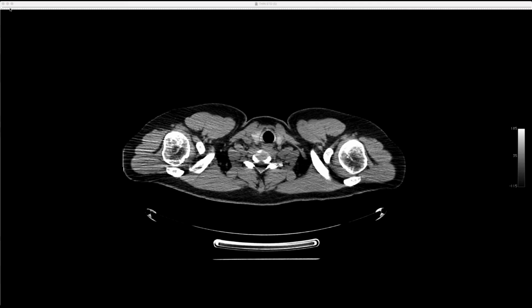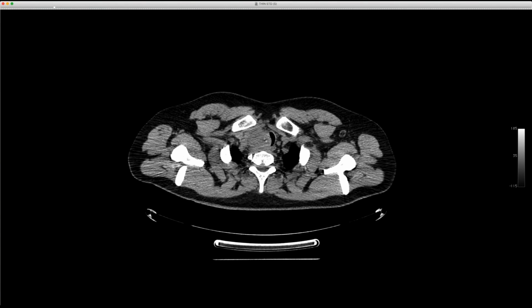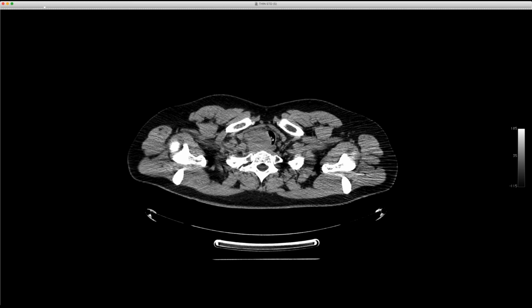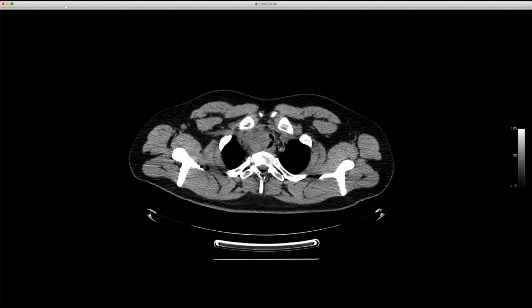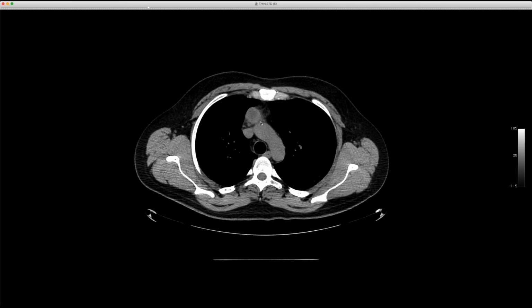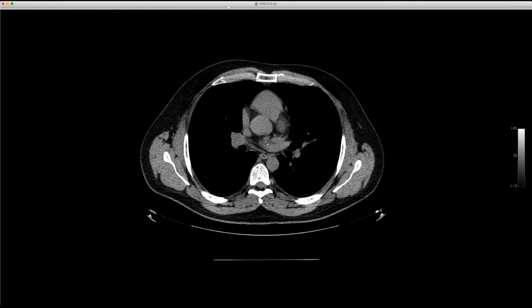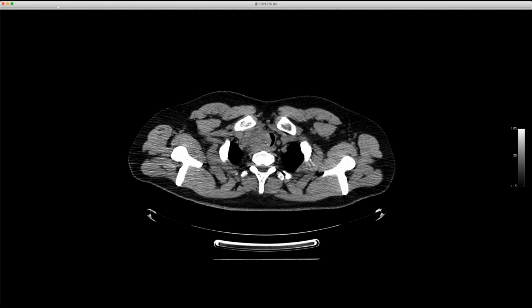Yep. All right, so this is a young patient who also has an airway lesion here, in the lower neck, upper mediastinum. You can see a lot of it is extrinsic to the trachea, pushing on the lumen. It's a nice smooth interface here. They did a scope and biopsy, and you see there's this necrotic looking mass in the anterior mediastinum. So this ended up being a Hodgkin lymphoma.